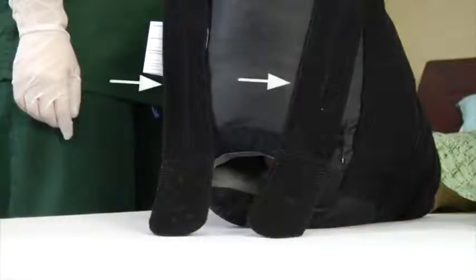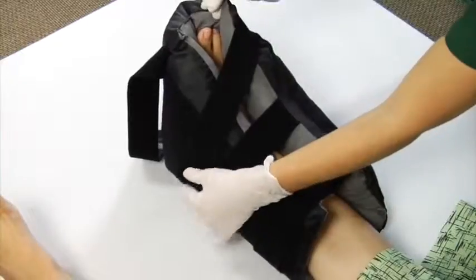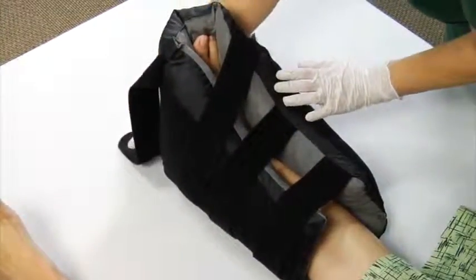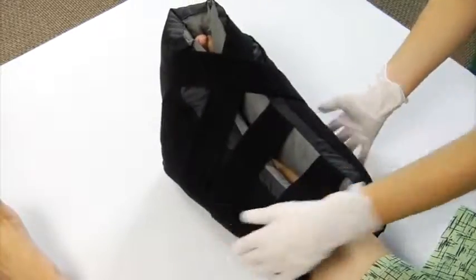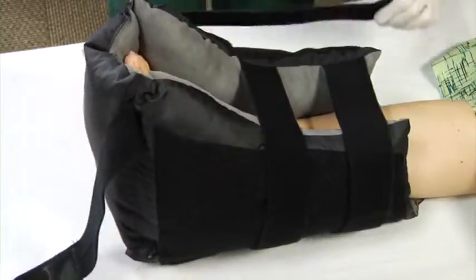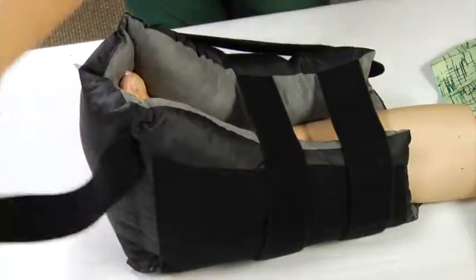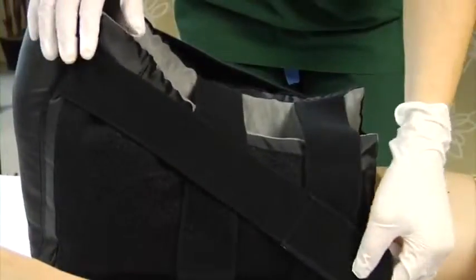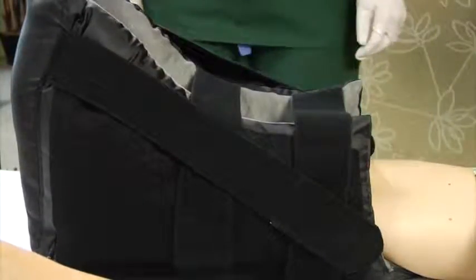There are 2 ways to use the lower straps, that is the 2 straps closest to the toes. Option 1 for the lower straps is to crisscross them, making an X. This strapping option offers good protection, keeping the foot and lower leg secure. Option 2 for the lower straps is to position each of the lower straps on its own side of the leg at a slight downward angle from the toes to the side of the leg. Using this option, the lower straps do not cross each other.